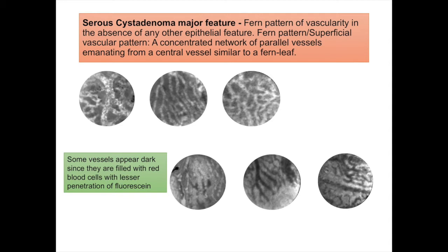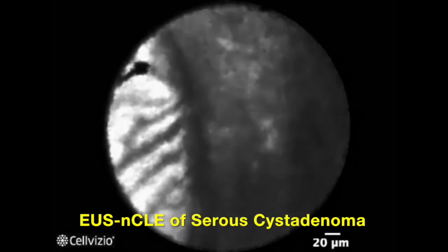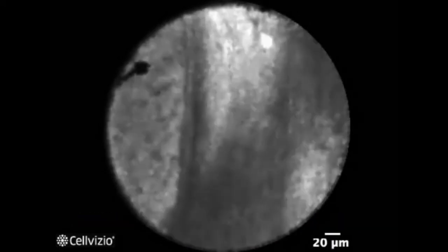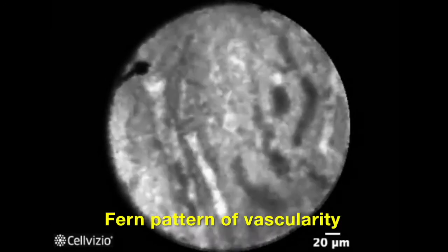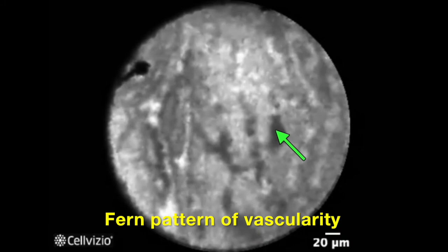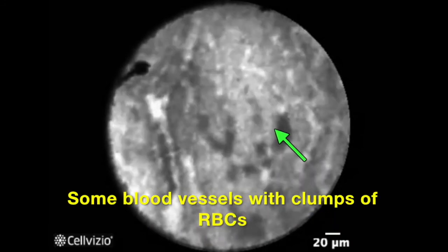In the next few videos we will see serous adenomas with both types of blood vessels: those where you have a higher penetration of contrast and the blood vessels appear bright, and those where there is a lower penetration of contrast or the blood vessels are packed with RBCs, hence giving them a much darker color. In this example, you see blood vessels with flowing RBCs. There is a higher density of RBCs at certain areas.